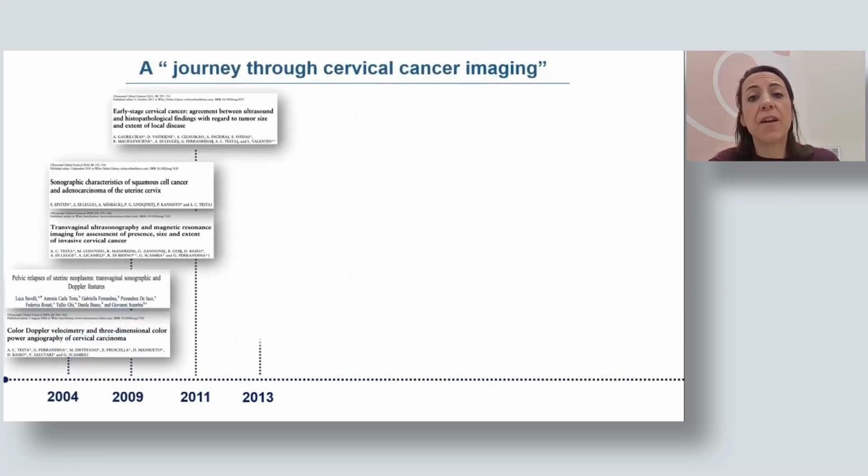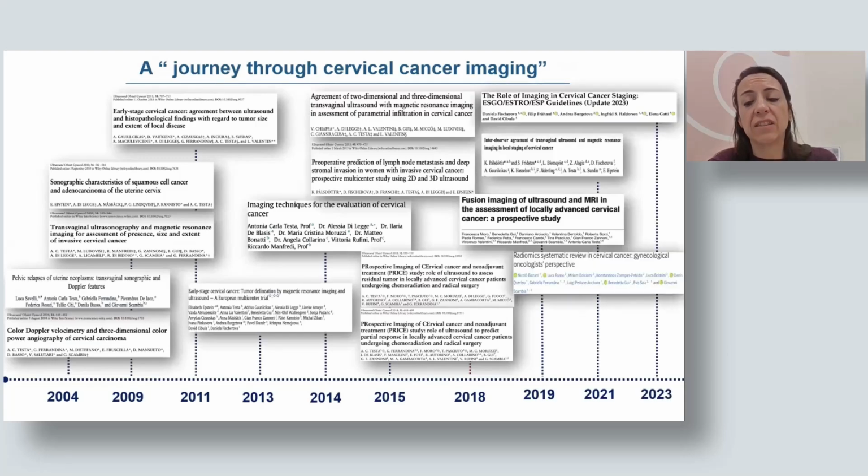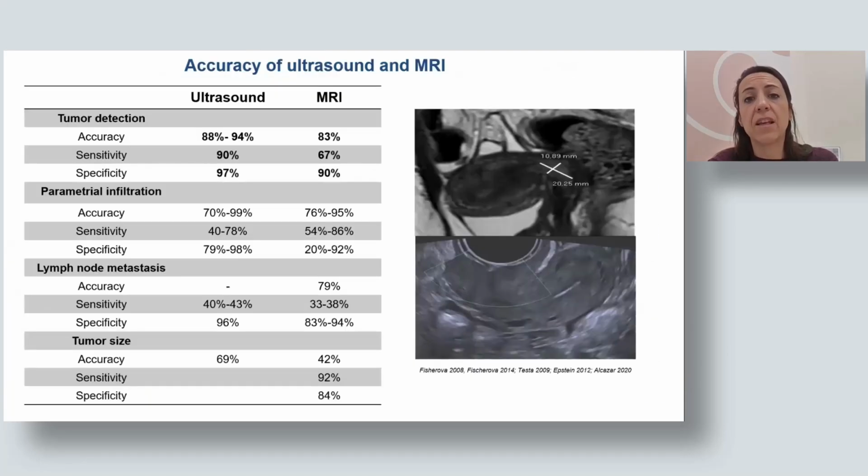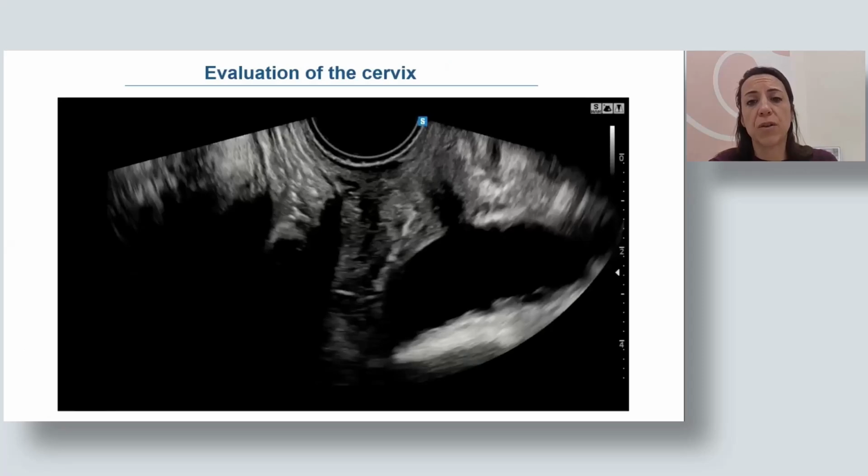Many studies have been published on ultrasound and cervical cancer. It has been established that the accuracy, sensitivity, and specificity of ultrasound examination when performed by an expert are similar to MRI regarding tumor detection, but also the evaluation of parametrial infiltration.